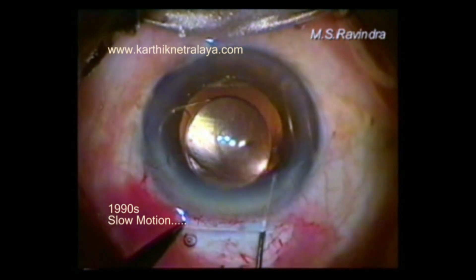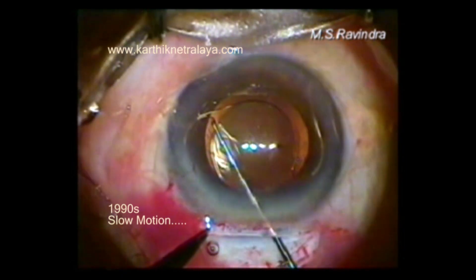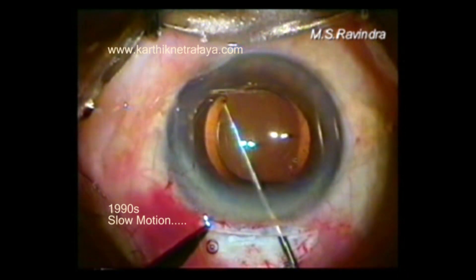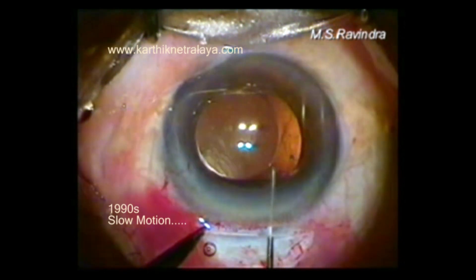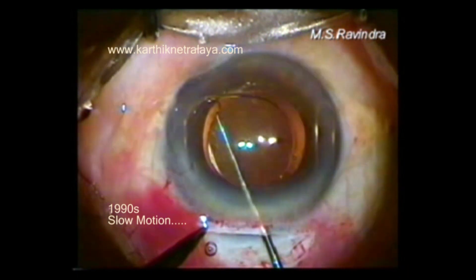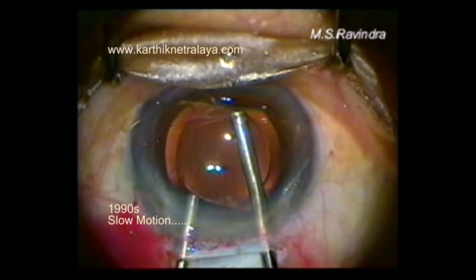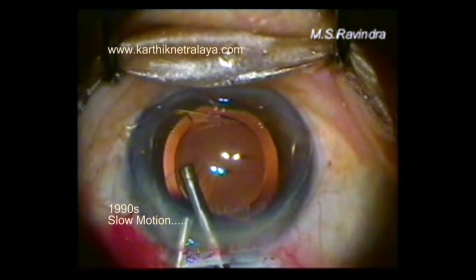Deepen the chamber to a certain extent so that the periphery of the AC falls back from the cornea. As you are withdrawing the haptic away from the angle region, slightly lift it up so that there is no impinging of the peripheral iris root against the haptic. Withdraw it from the angle, lift it up, and release it. Continue doing vitrectomy and ensure that the viscoelastic is completely removed from the eye so that postoperative pressure does not occur.